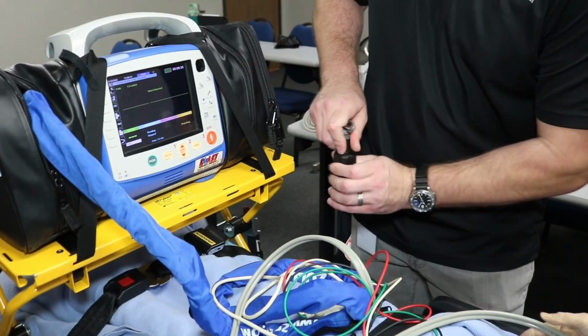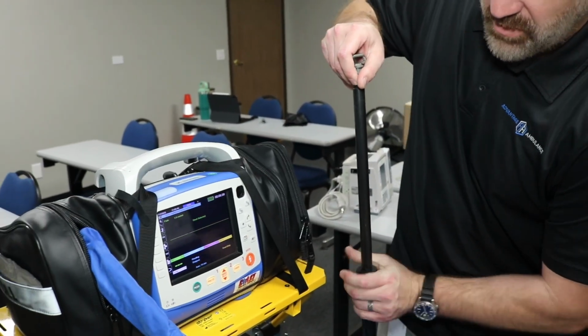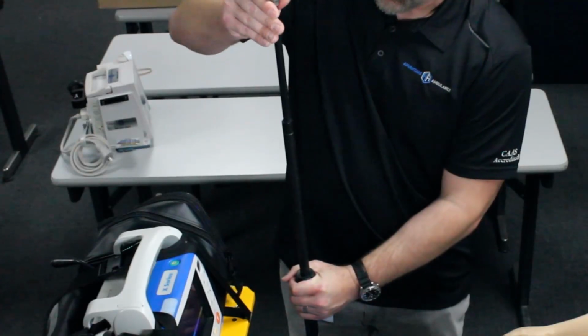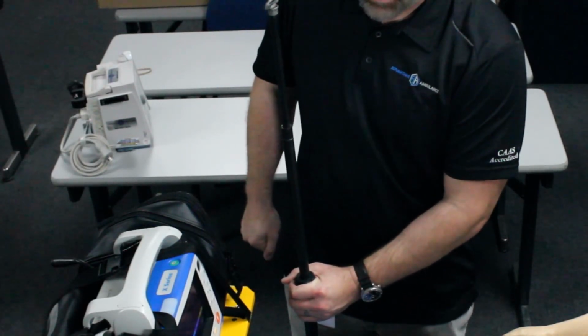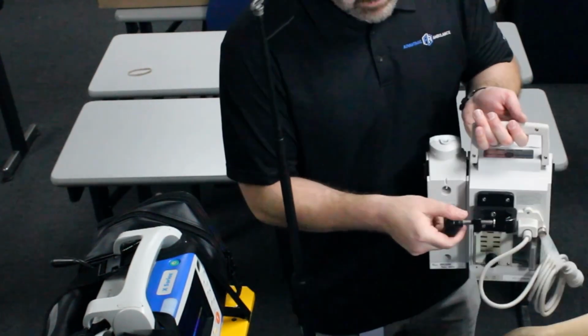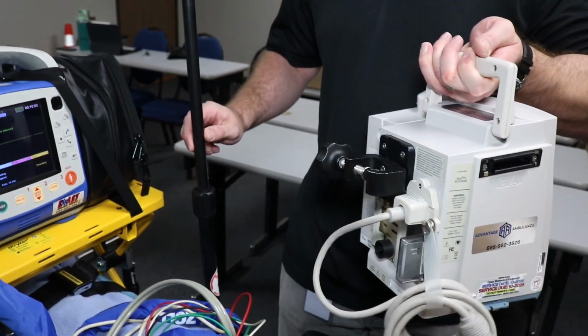We are going to untighten this, bring it all the way up, and make sure we tighten this down nice and firm so that it does not slide down. And this will extend all the way up. Our fluid bag will be hanging here while we mount our pump, utilizing our securing screw to the IV pole.